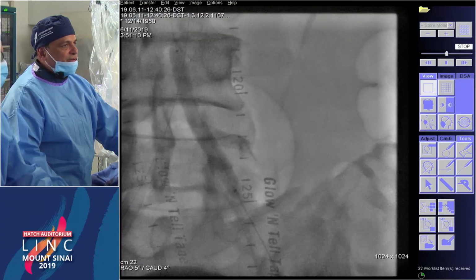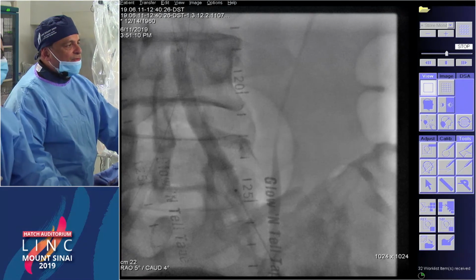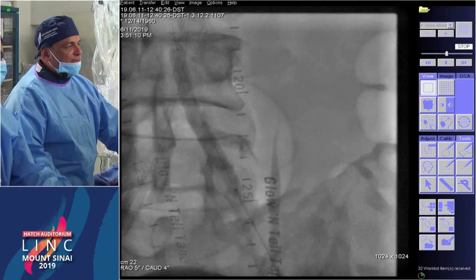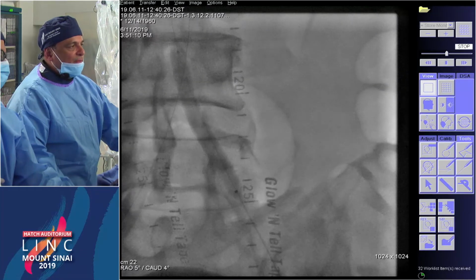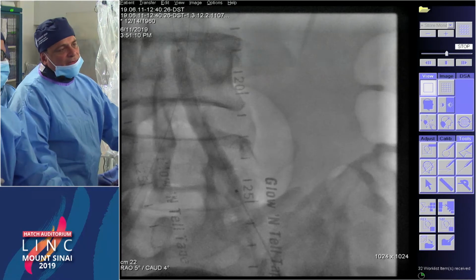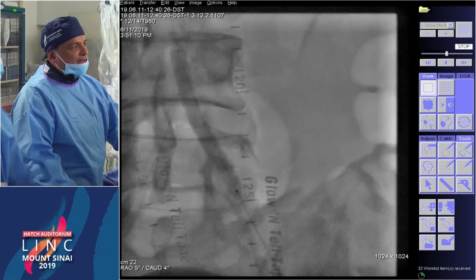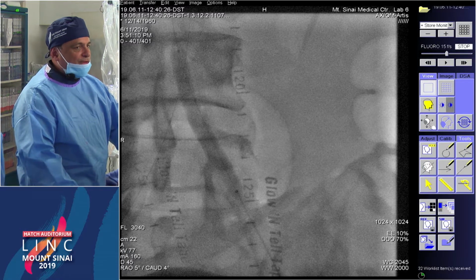It's obviously grossly undersized there, so I'm not worried about causing any damage. And I'm just expanding it right in the middle zone that Dr. McKenzie was saying for another 30 seconds. And then when we're done here, we're going to have to switch out and then decide what we want to do. Well, in this stage, it actually almost makes me feel like we don't need to do a covered stent. And I'm curious what you guys would do.